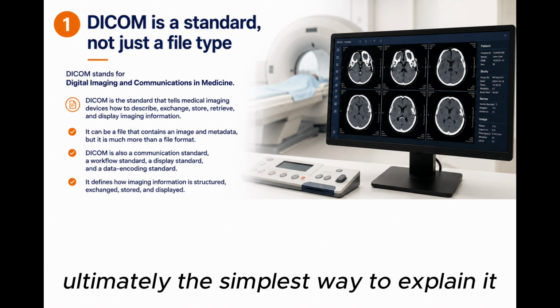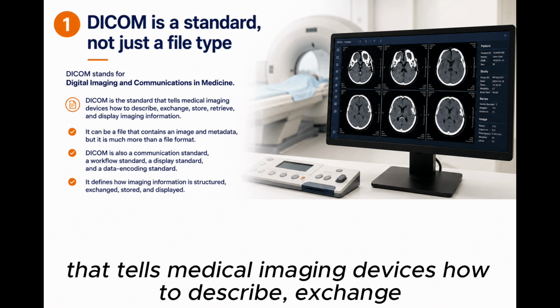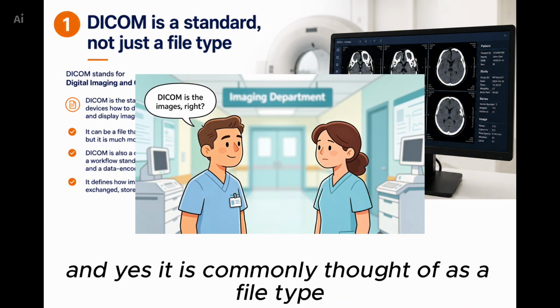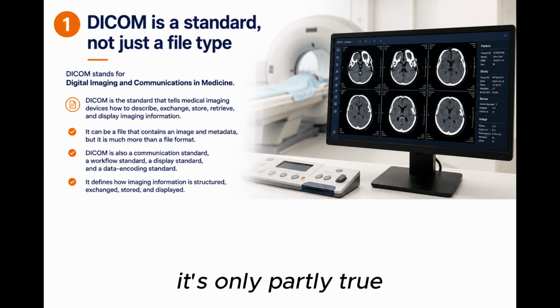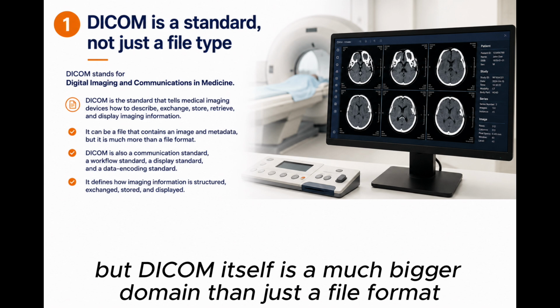Ultimately, the simplest way to explain it is that DICOM is the standard that tells medical imaging devices how to describe, exchange, store, retrieve, and display imaging information. And yes, it is commonly thought of as a file type because that's what really sits on the surface of it. But while that's not incorrect, it's only partly true. A DICOM file can contain an image and its medical metadata for sure, but DICOM itself is a much bigger domain than just a file format.